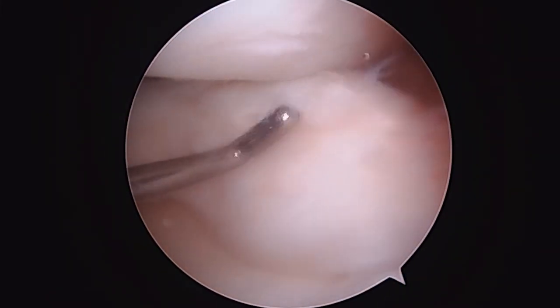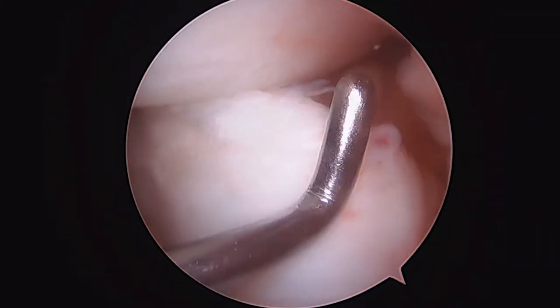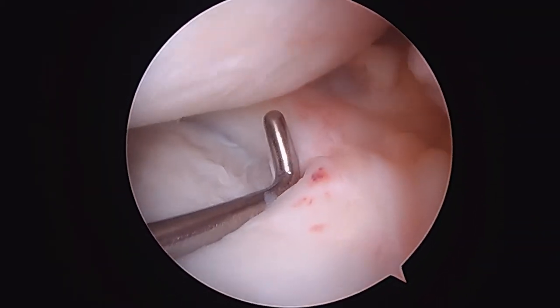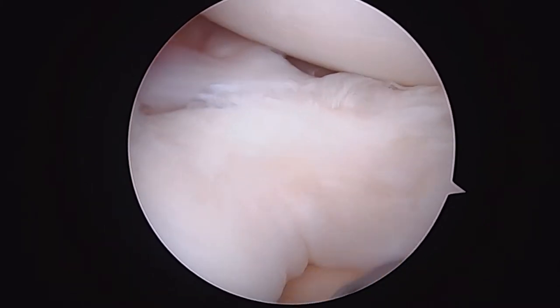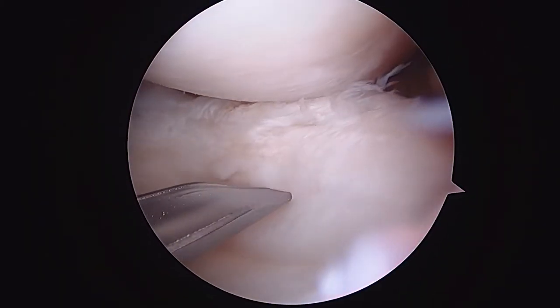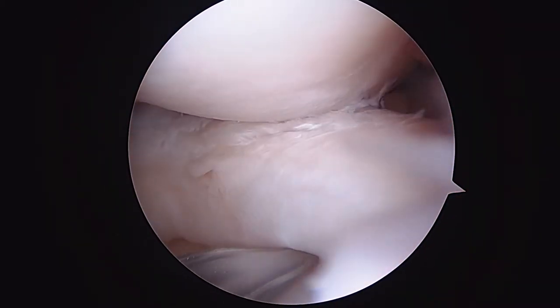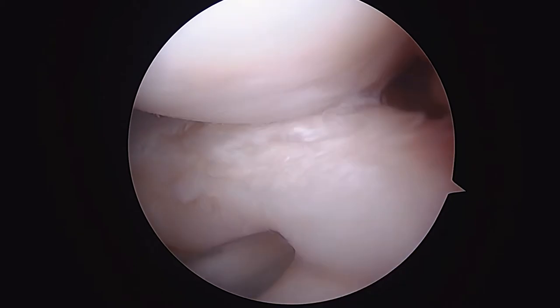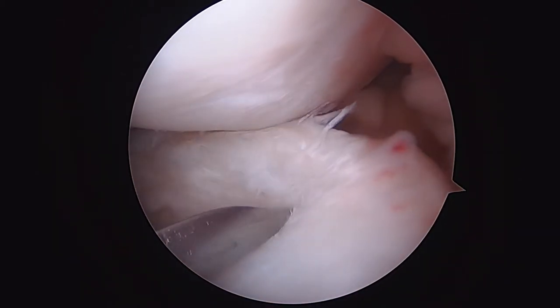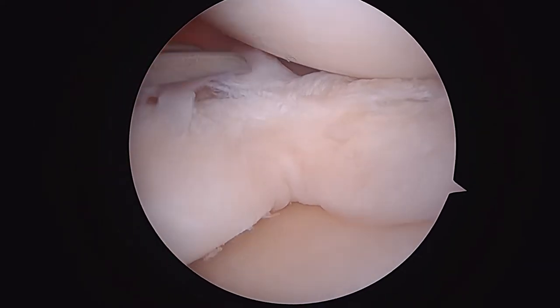That's what we're going to try and reconstruct — get this meniscus looking like that again. We're using this little spatula, sometimes called a skid. It guides in our repair device, and I'm using it to make sure I've got this reduced. I'm also trying to get an idea of the tissue quality.